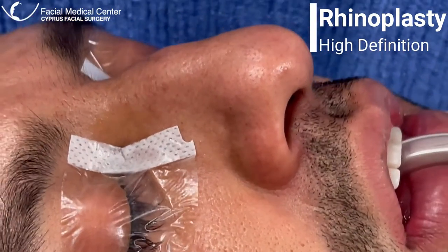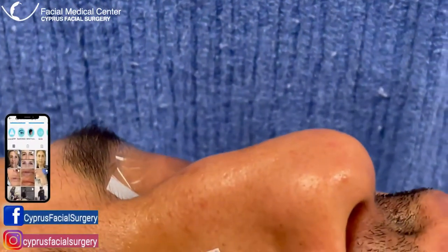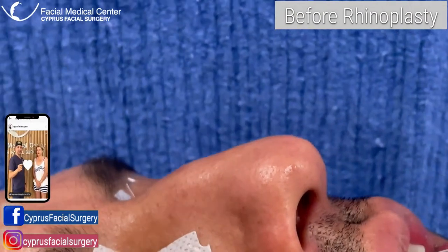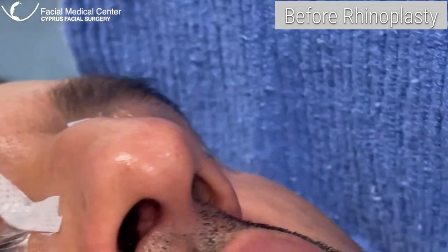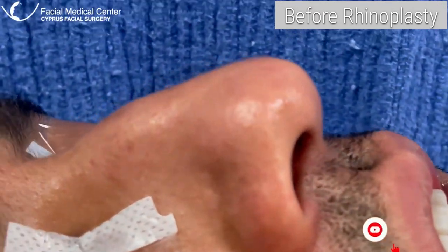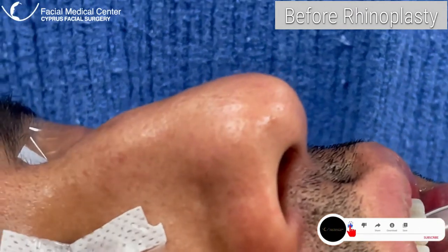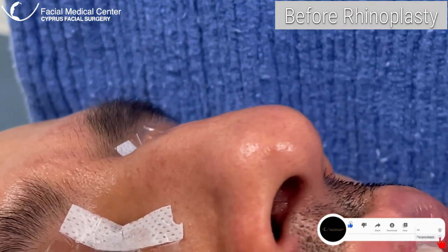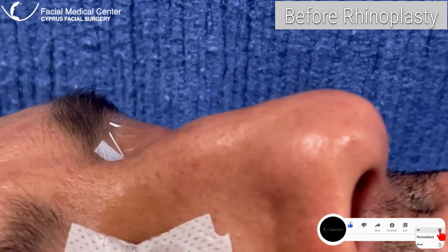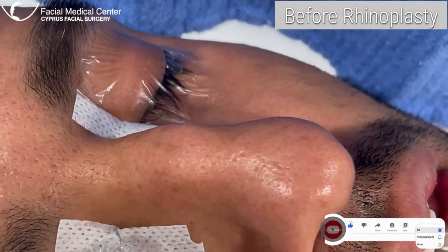We're back in the operating room, and as you can see here, we have a patient for septal rhinoplasty, a revision actually, septoplasty and rhinoplasty. And again, this patient has a lot of problems with the breathing because of the internal nasal valve. As you can see here, we have a nasal hump deformity. We have a very bulbous and rounded tip. We have a down rotation of the tip that needs to be supported. And of course, we have a lot of asymmetry on the aesthetic lines of the middle and superior nasal vault.